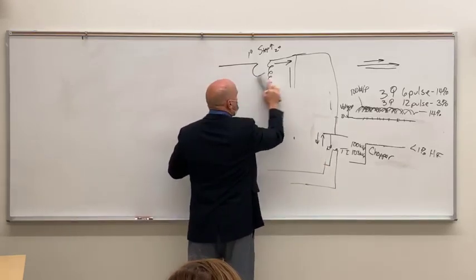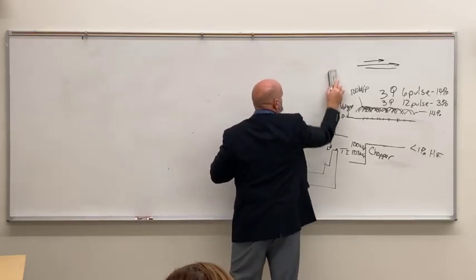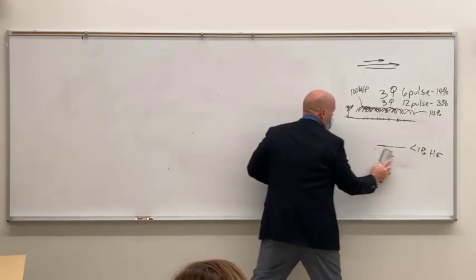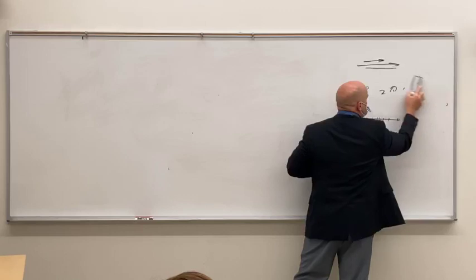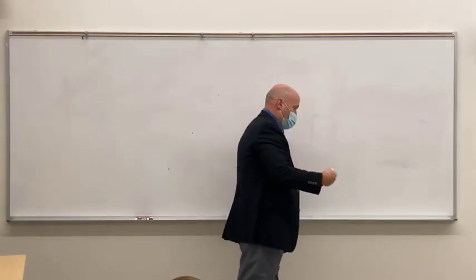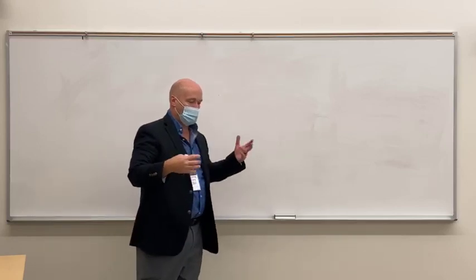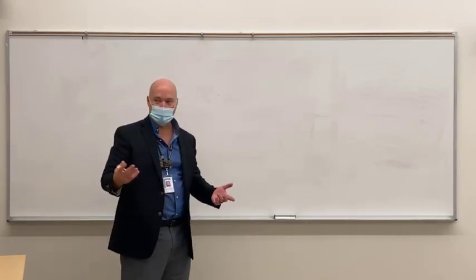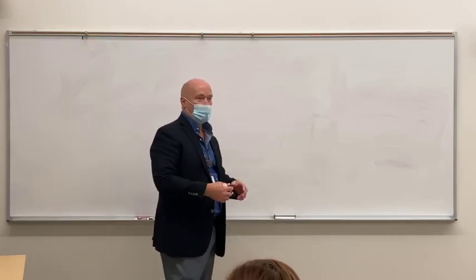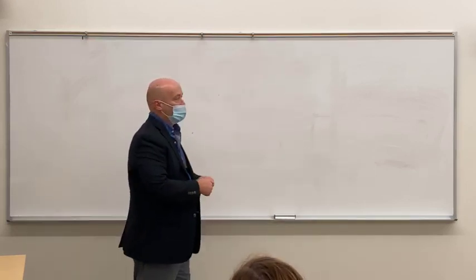What you've got in a capacitor is kind of like 2 electrodes, like in the X-ray tube, but with a layer of insulation in between them. I'm going back to where we talked about static electric charges: holding a static charge in the wintertime, you essentially become a capacitor.